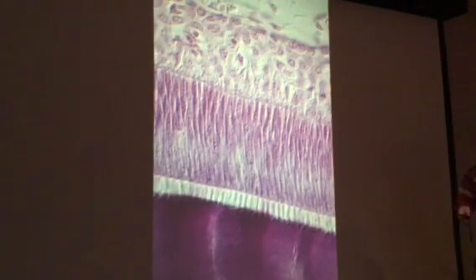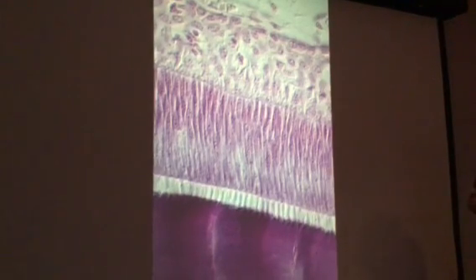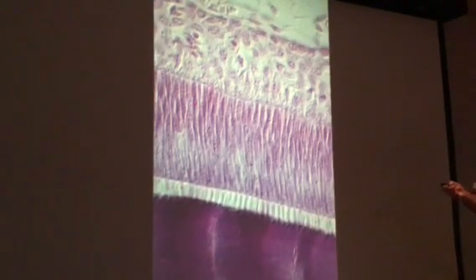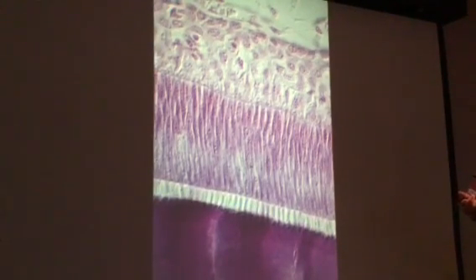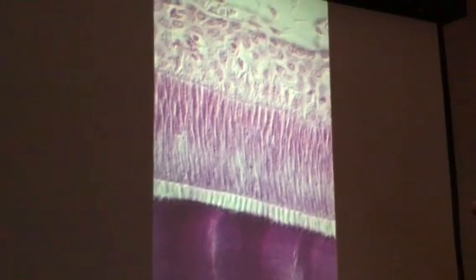And those will be demonstrated or quizzed with the rat incisors that we looked at in lab. Dr. Petey? Yeah. Can you explain which side's the proximal and distal? Okay, distal side is where it's actually secreting. And that's the proximal side. This is the only place where those terms are used. Otherwise, you'd use basal and apical for an epithelium. But because these things have reversed their polarity, they've used those terms instead. And recall that they will reverse their polarity again when they fuse with the oral epithelium during eruption.